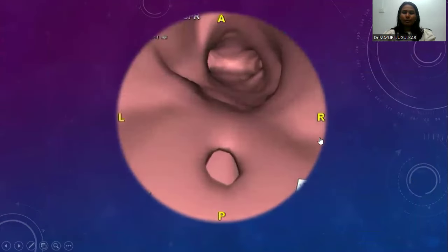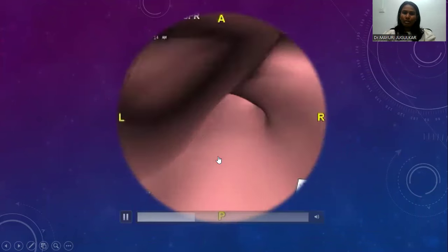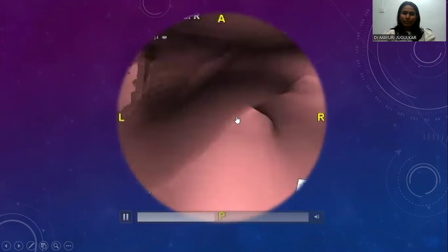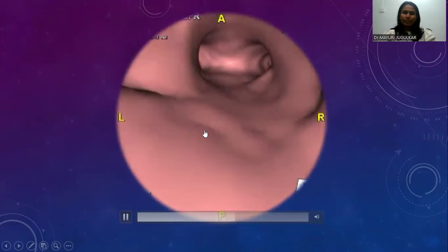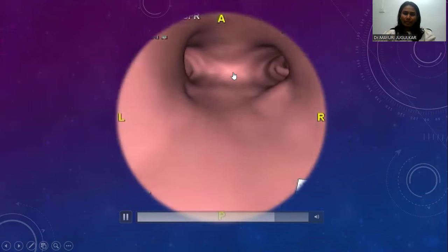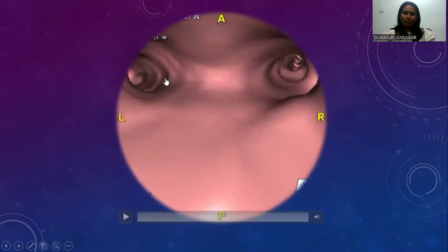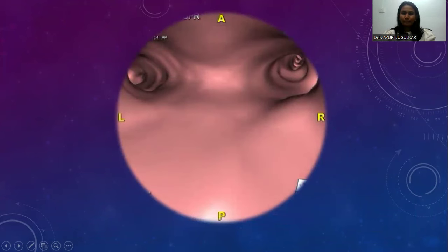On virtual bronchoscopy this is the fistula, esophagus, trachea, this is the carina, left main stem bronchus, right main stem bronchus.